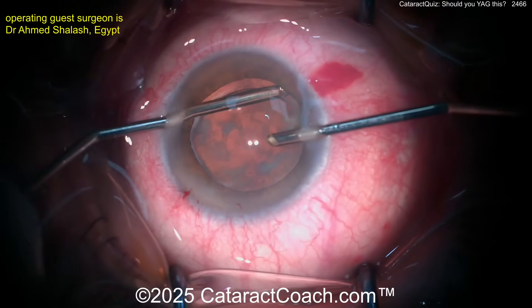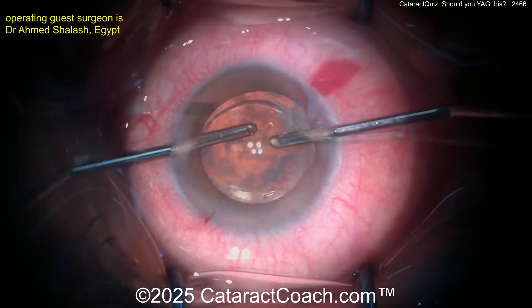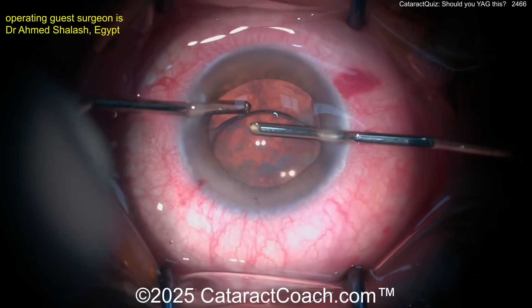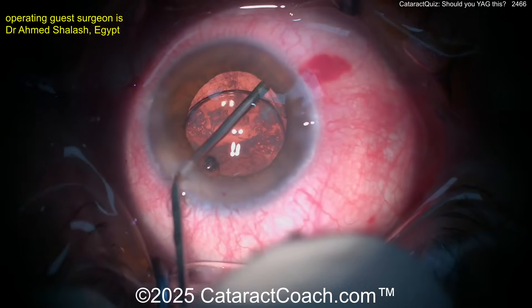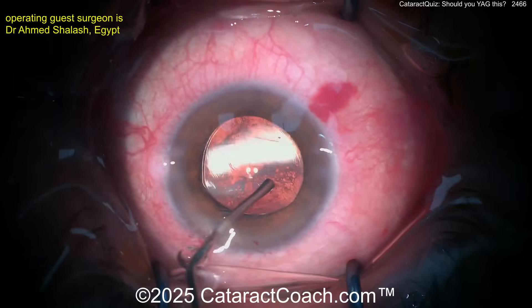That's a good idea — can you lift this up and go behind there and vacuum underneath? Very careful. Lift that up — there we go. Now you've got hold of the lens. Can you go behind the optic and just aspirate all that material? It's kind of tough. Here's some viscoelastic now to separate the capsular bag and open it up a little bit.